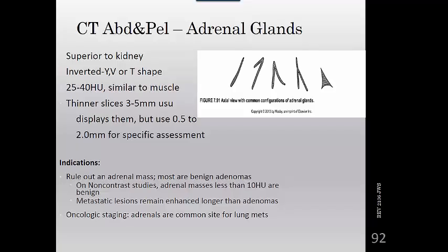And because accurate characterization often requires an adjustment in the scan protocol, the CT tech should be familiar with that current information, because an astute technologist can save a patient time, money, and the radiation exposure of repeat examinations by identifying those incidentalomas and tailoring the study to provide the radiologist with the data necessary to characterize it as a benign or malignant mass.